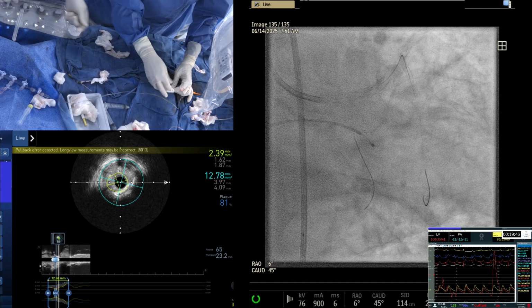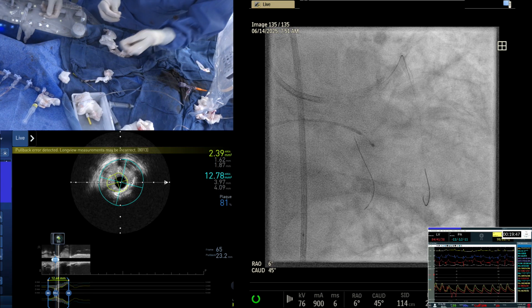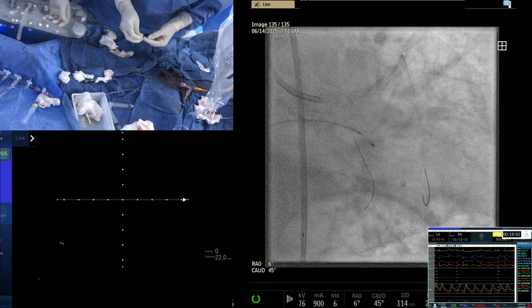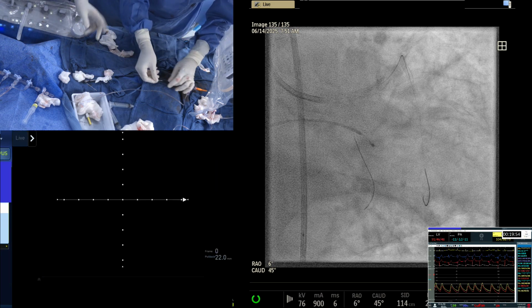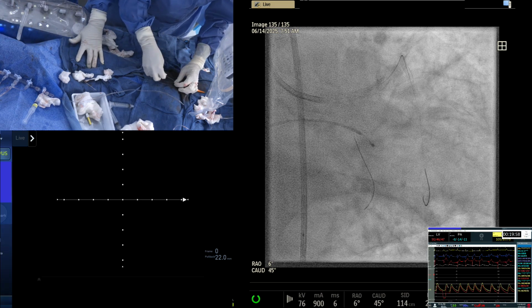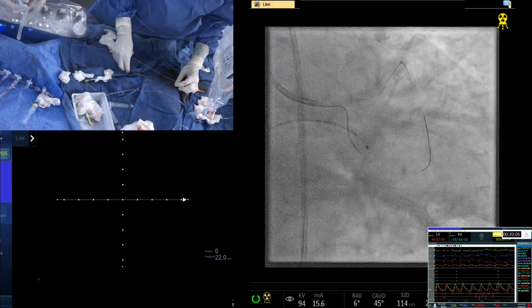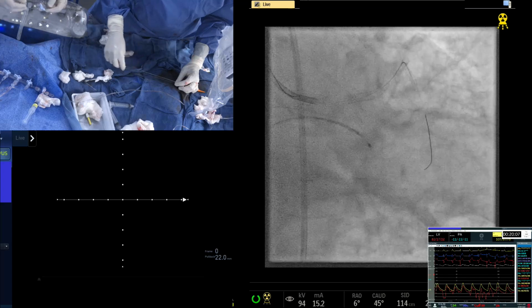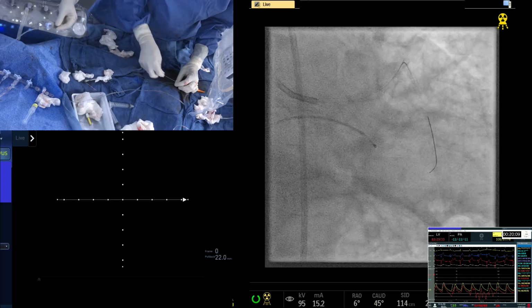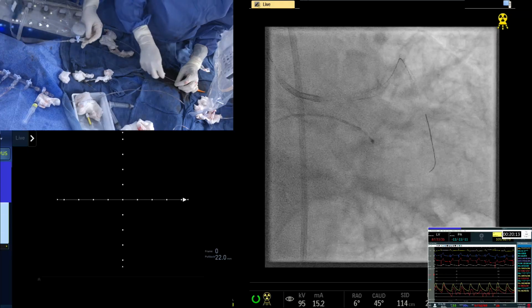We just, there's a very interesting case of the super CHIP. Ready? Yeah. Super CHIP is combining, about 7 years ago, when we had a live relay to ACC, we did the same thing: balloon valvuloplasty and PCI of the left main bifurcation. Then one time in the CRT, we did the same: balloon valvuloplasty and PCI. IVUS is ready just to check the final optimization in the left main.